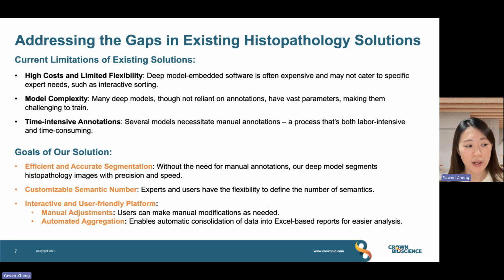The third is that we want to embed our deep model into an interactive and user-friendly platform, and this platform can make the pathologists manually modify the parts that they need. And the fourth is that we want the platform to automatically generate Excel-based reports for the pathologists for further analysis.